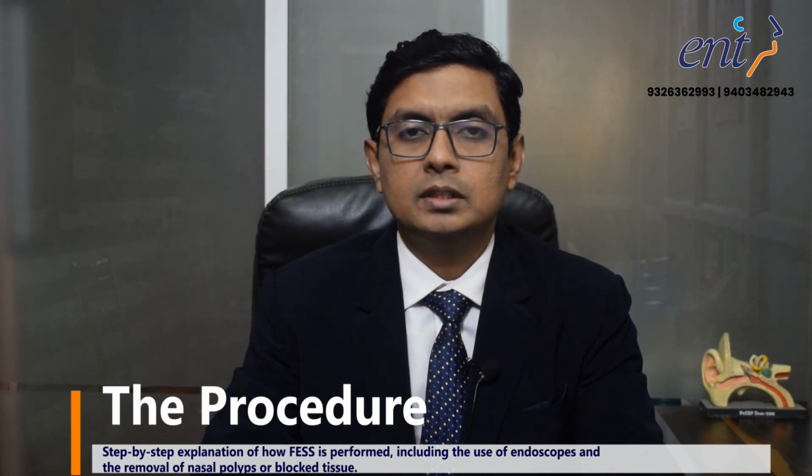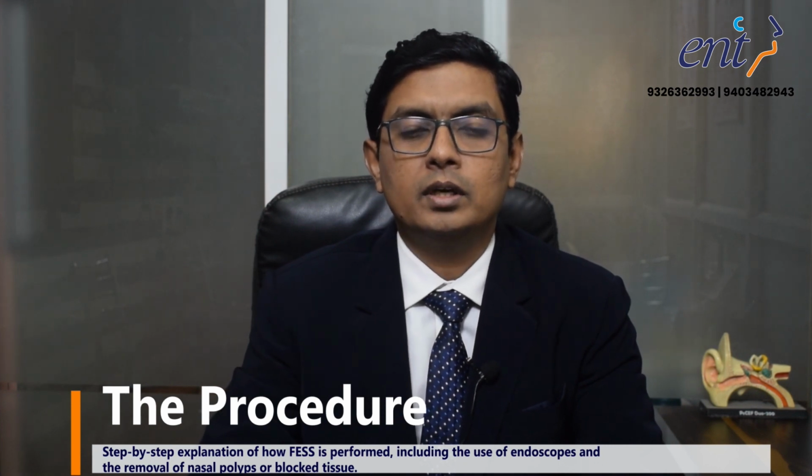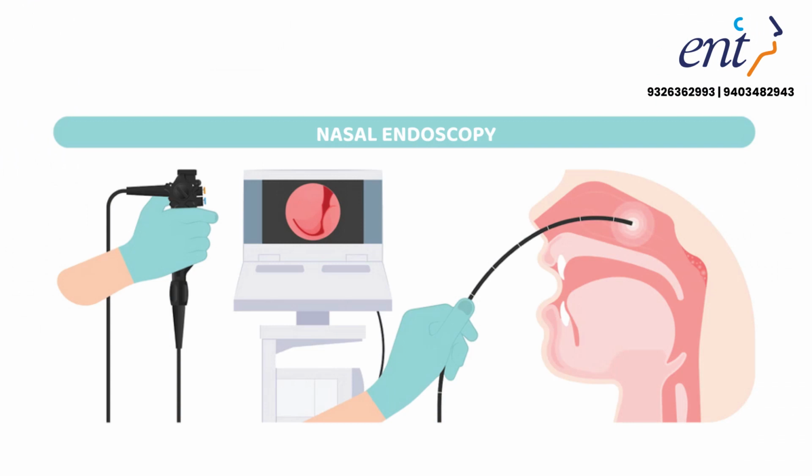If a patient is having recurrent sinusitis, then we evaluate the patient by doing nasal endoscopy, anterior rhinoscopy, and many times a CT scan. This is to understand the disease, how much infection is inside. There are different groups of sinuses involved. There are 4 groups of sinuses on each side of the face. We have to understand which sinuses are involved, how much is the blockage, and what is causing the blockage to the ventilation pathway.